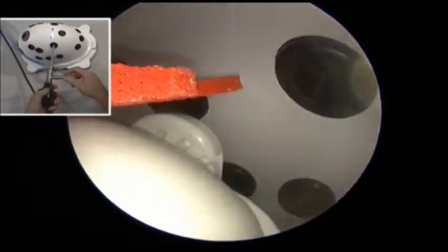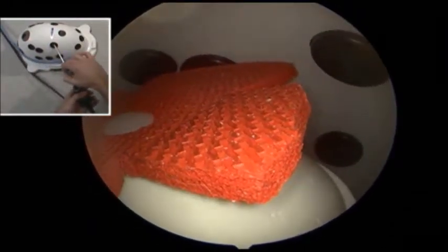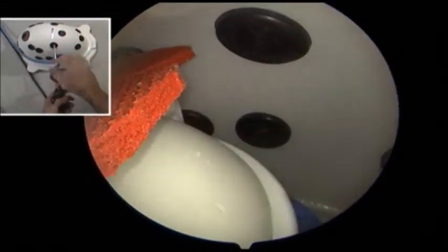To orient for portals, I'm going to use this as a posterior visualizing portal. This can be a lateral working portal, this can be an anterior working or suture retrieval portal, and this can be an accessory lateral portal here. So the scope is placed posteriorly. We'll now orient ourselves so that we see the lateral edge of the simulated rotator cuff.